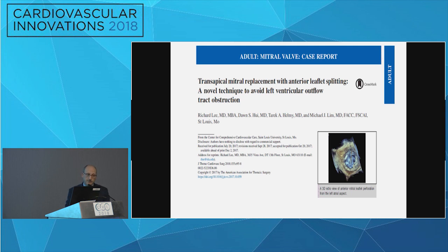Couple questions, great example there. When you're ballooning, what size is the balloon? We usually use between 18 and 20 millimeter aortic valvuloplasty balloon. Have you had issues with torrential MR in between, while you're trying to get the valve in place? I mean, that might be more of an issue with transseptal.